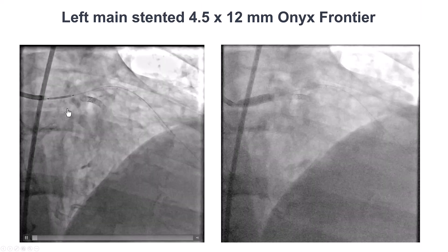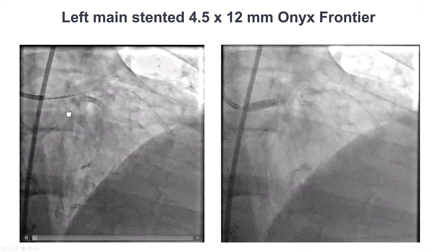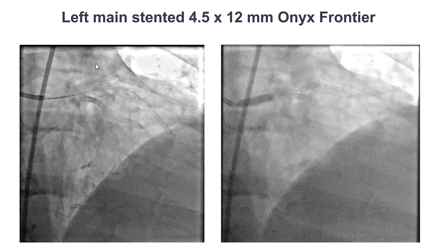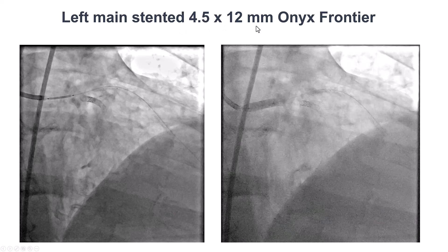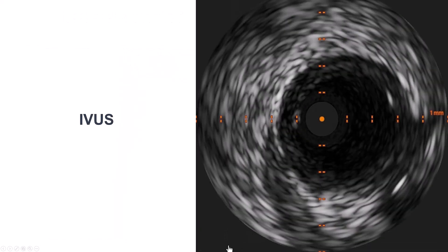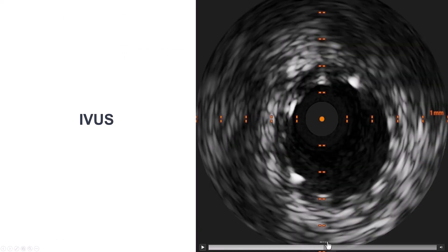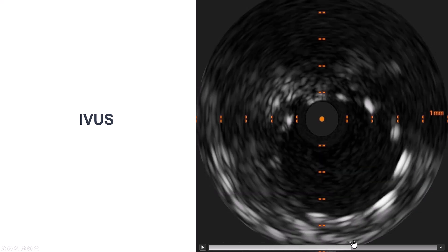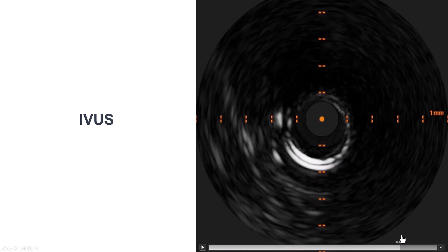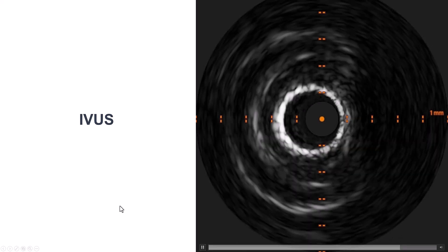We did intravascular ultrasound to better understand what is going on in the left main. We can actually see here that there is some tissue — it looks like a flap inside the ostium of the left main — so this is a left main dissection. The patient was very stable. There was no compromise in flow, but still we did not want to leave it untreated. So we placed a 4.5 by 12 millimeter Onyx Frontier stent, and this gave a nice result both by angiography and also IVUS, with good coverage of the left main, essentially going all the way out into the aorta.